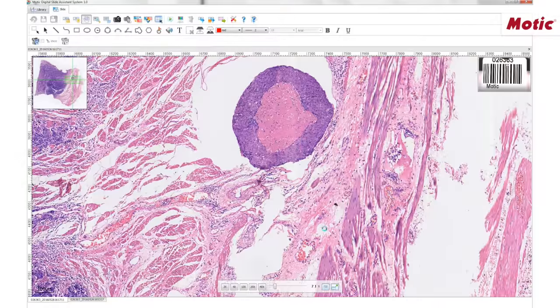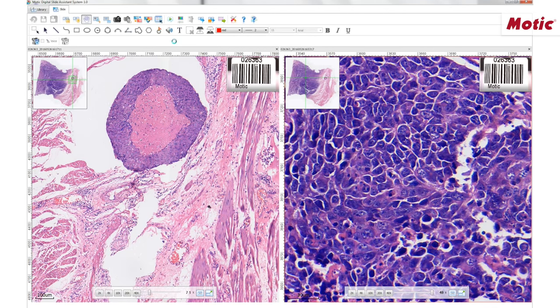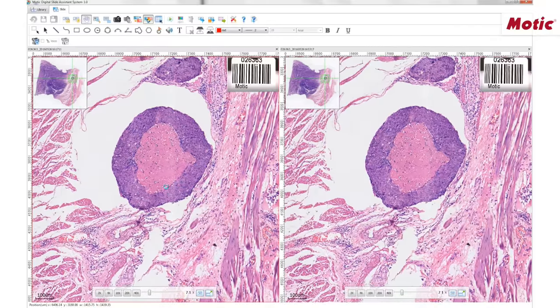Comparison between multiple digital slides is another interesting tool in this software. This can be extremely useful when comparing similar sections with different stainings, or when similar sections from the same patient have to be contrasted over time. Synchronization of the images can facilitate their comparison, as well as make image processing easier. If you want to visualize more than one image on the screen, just use one of the split options. Once you have the different images on the screen, you can choose between fast synchronization, which synchronizes images according to their current position, or full synchronization, which synchronizes according to the XY position of the images.